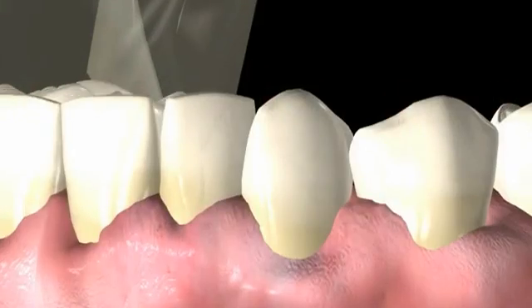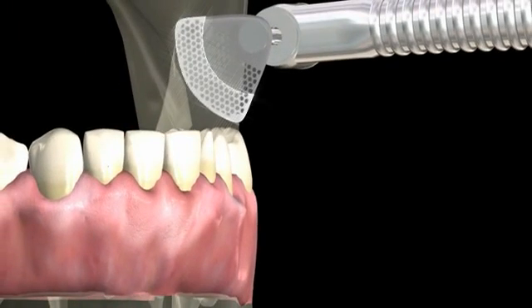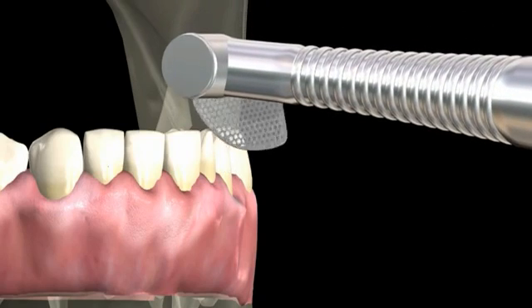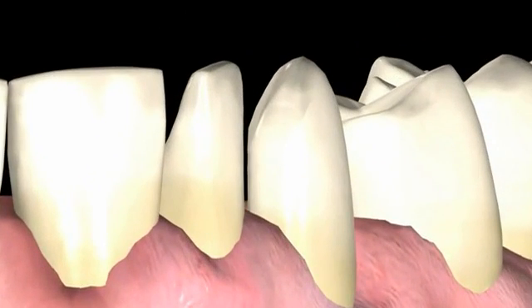A rotated tooth many times presents a challenge of damaging the adjacent tooth when preparing for veneers or full crowns. As seen here, the OS system allows the practitioner a safety net by using the cutting side of the disc to open the contact, while the non-cutting side protects the adjacent tooth.